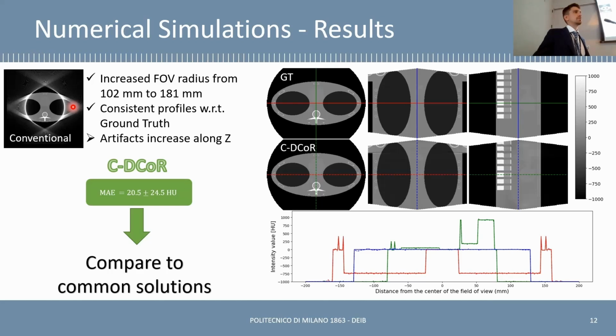Yeah, sure. No, I agree. This is a bit unconventional, I would say, to just show you this result. There's a better way to do it and to reconstruct the FOV inside here without having this truncation effect, these border effects. I totally agree.